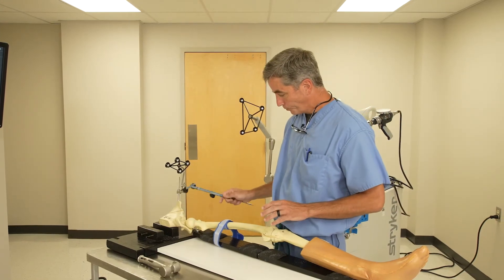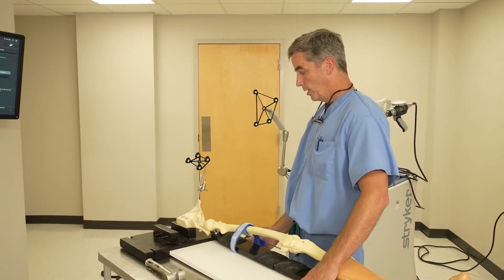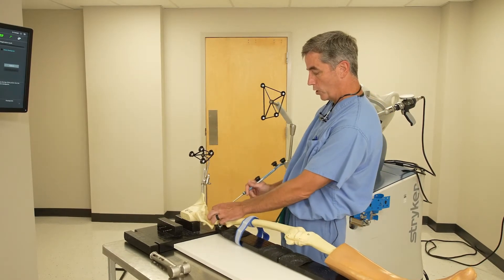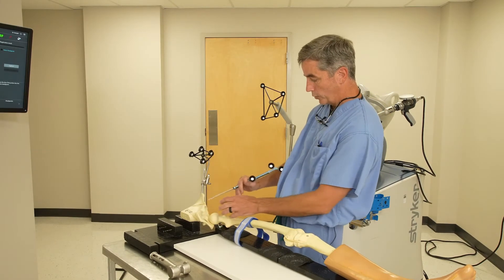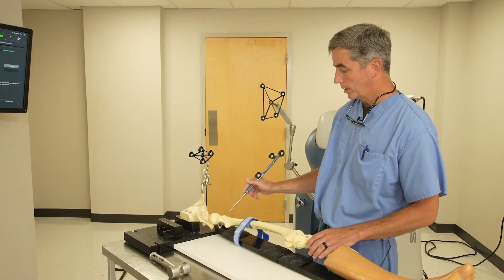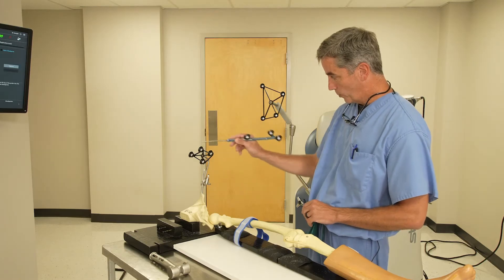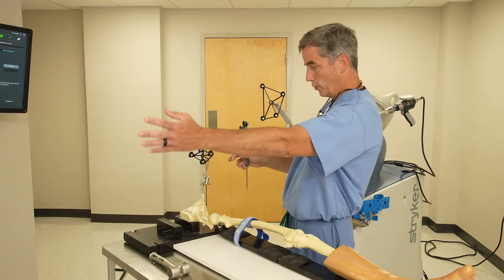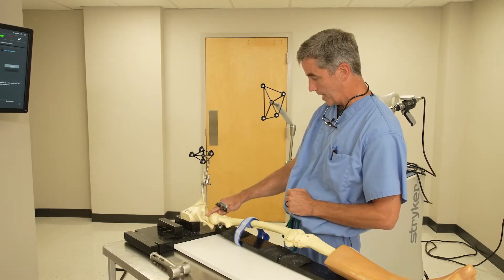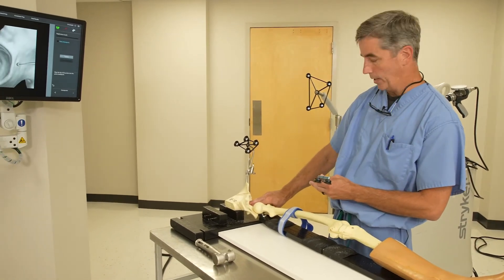With the robot, we do the cup. We've cut the ball off and moved it out of the way — the ball is gone. We have some retractors that show us the cup. The robot on a hip replacement is primarily used for the cup; we don't really use it for the femur bone. What we do is attach this array — which tells the computer where the pelvis is — to the pelvis. It's attached and comes down here to the cup. So if the pelvis shifts or moves, this moves with it and still knows where the cup is.